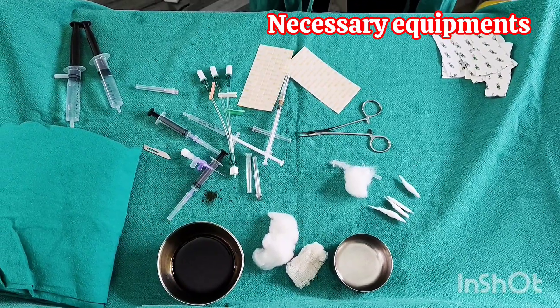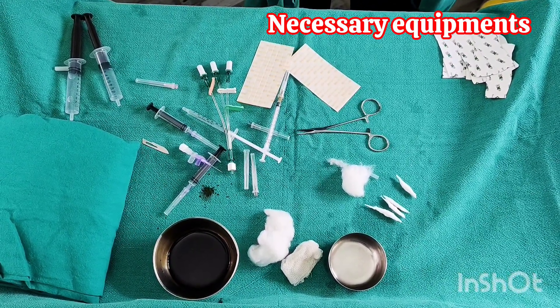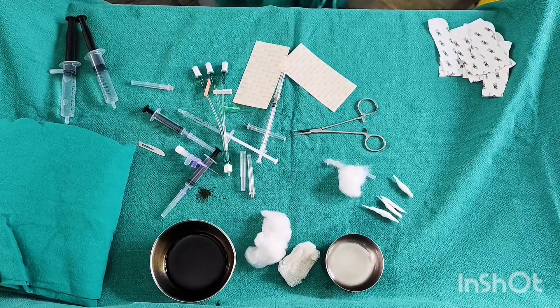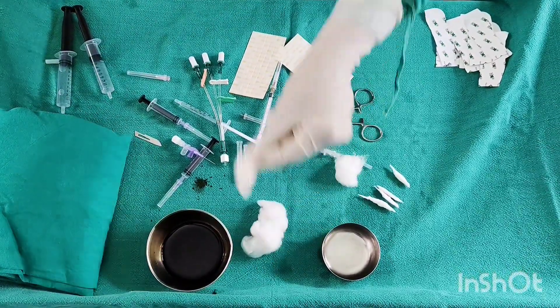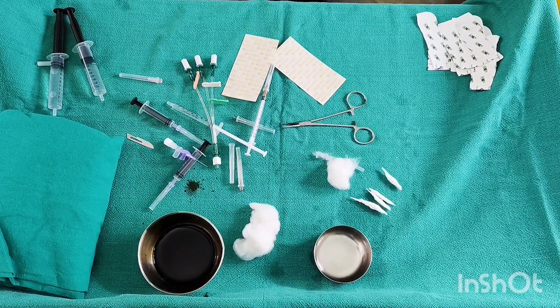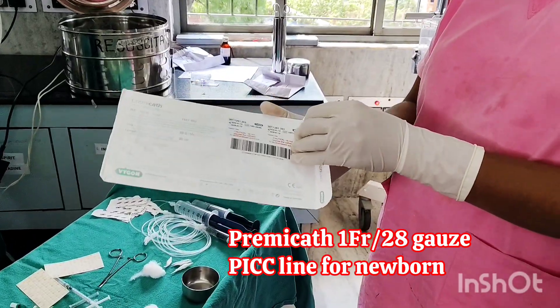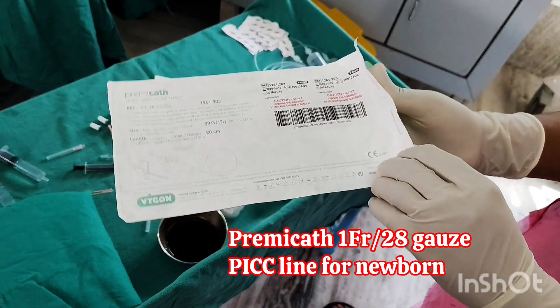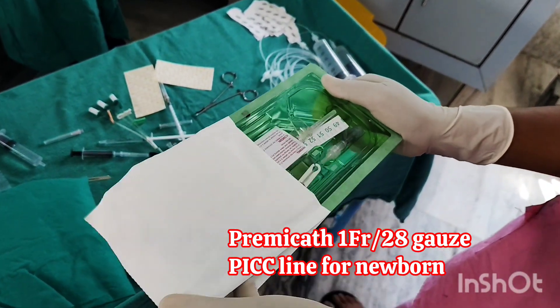Necessary equipment includes a 26-gauge intravenous cannula, 1 French PICC line, 10 ml and 1 ml syringes, heparinized solution, surgical blade, Tegaderm fixation, steri-strips, sterile gauze, cotton, napkin, sterile sheet, betadine, spirit, sponge holding forceps, and towel clips.